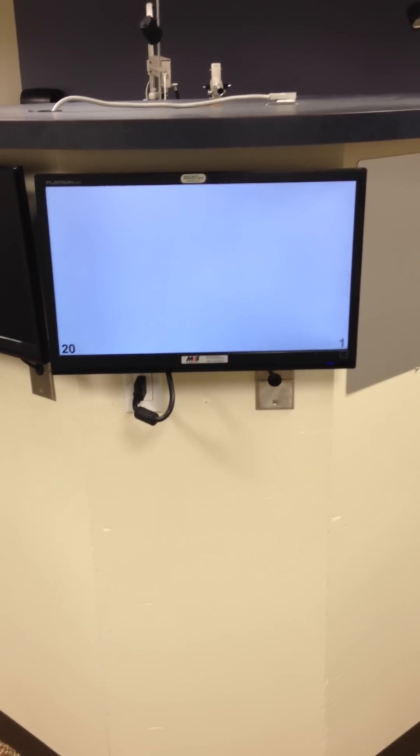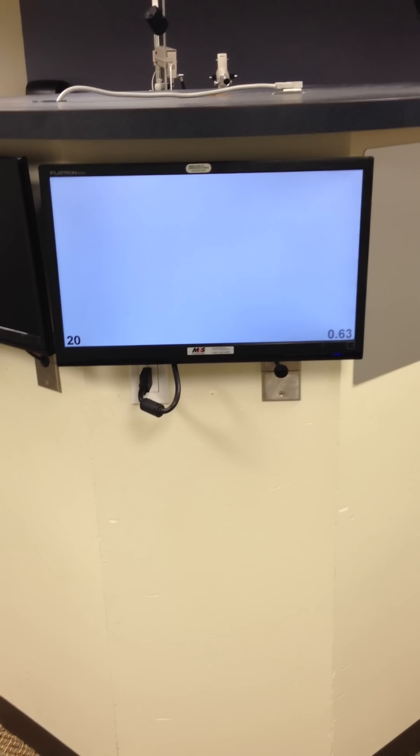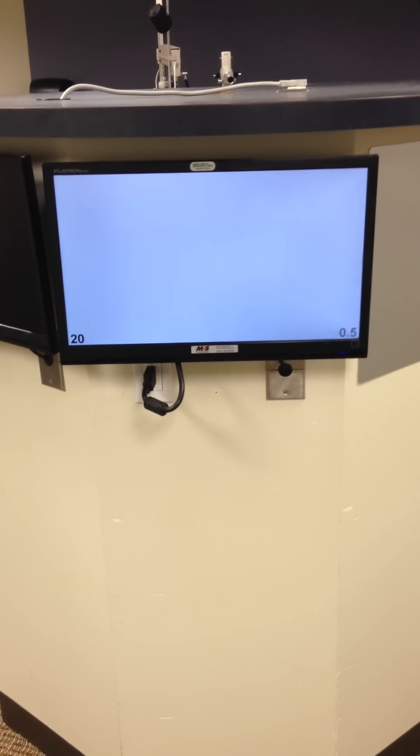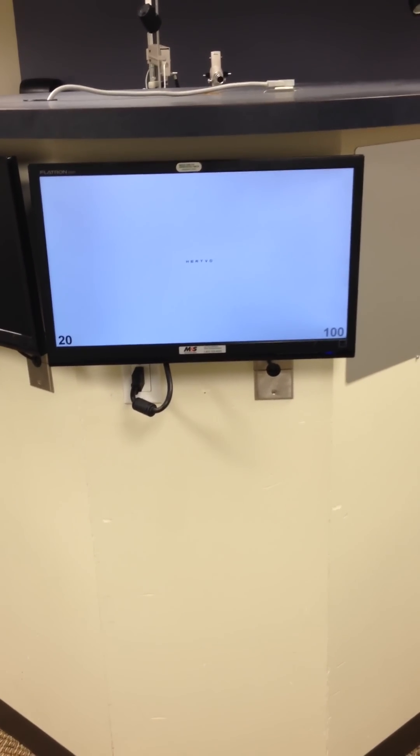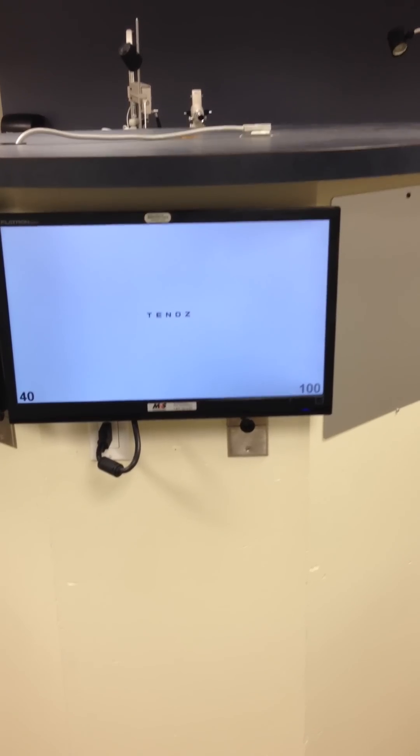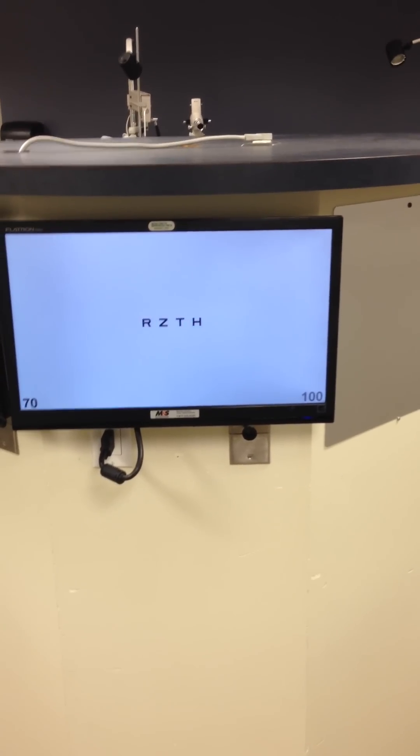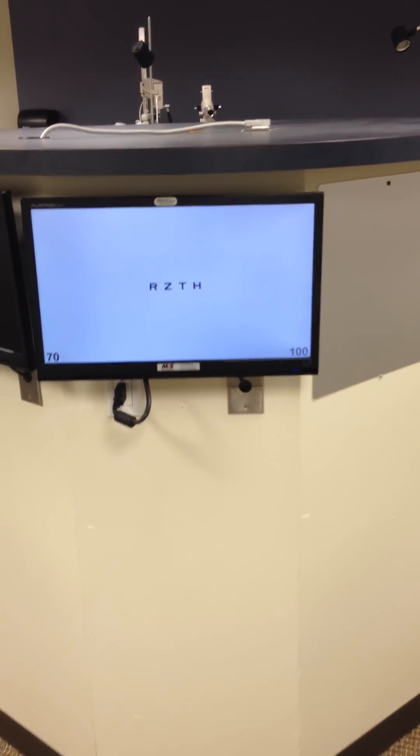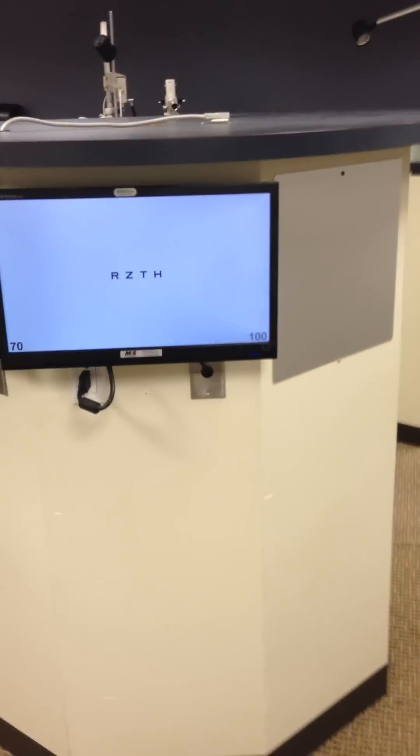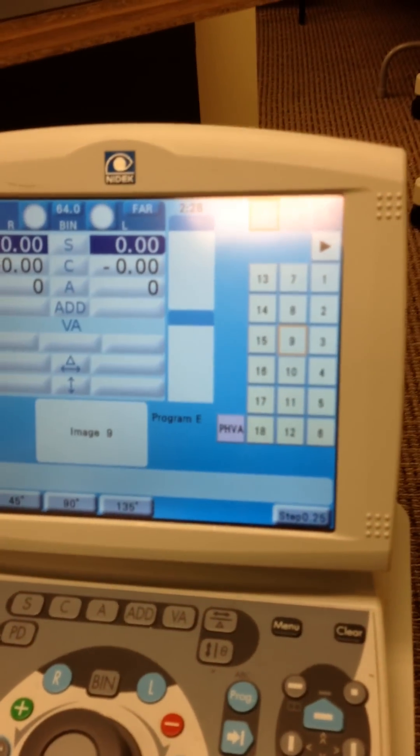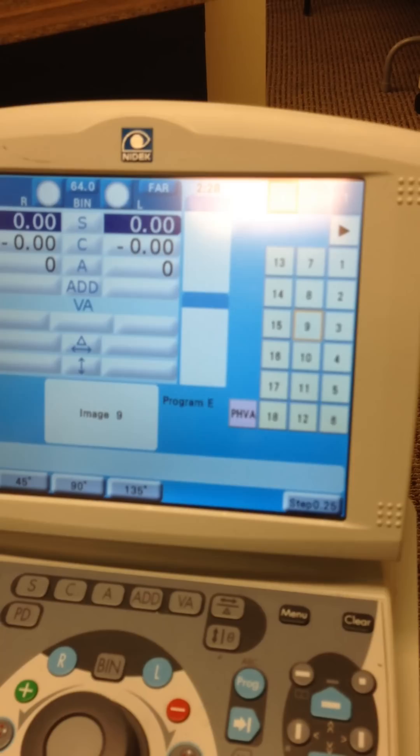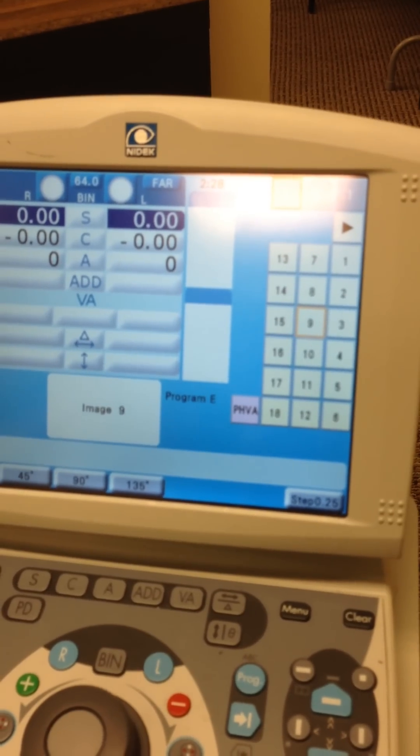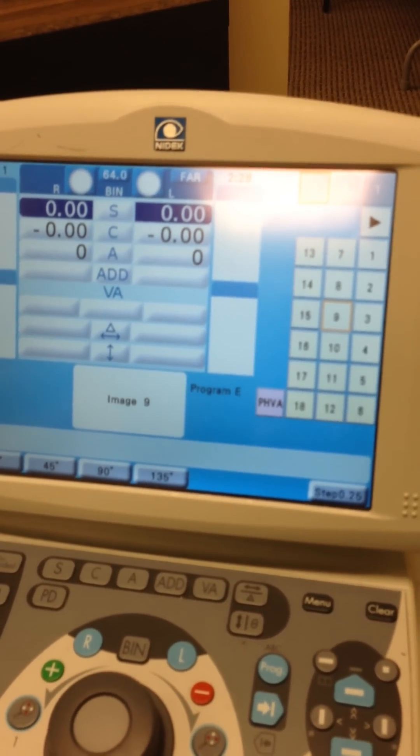And if you're doing this on amblyopia, I generally compare the same size letter for both eyes because of the effect the letter's size themselves have on contrast ability. That's not the same for all attendings, so you have to ask your attending on that. So there's a quick and dirty preview of how to use contrast and stereo, as well as a little bit of Ishihara stuff on the Marco projectors, rather the M&S charts and the Marco system.